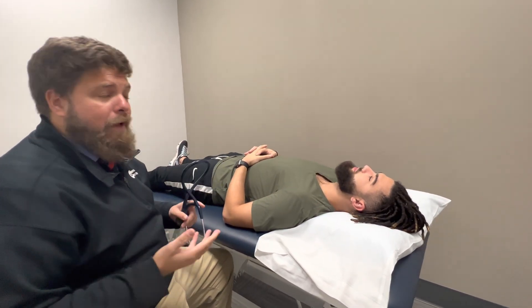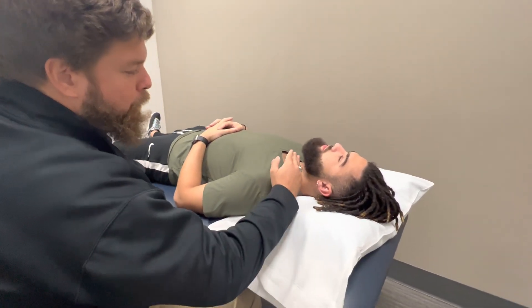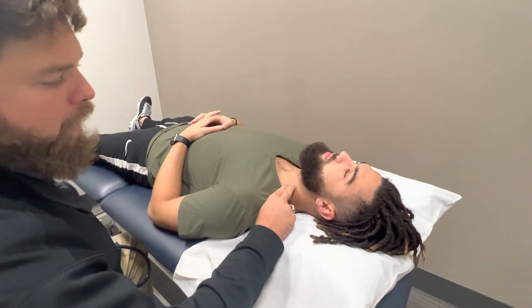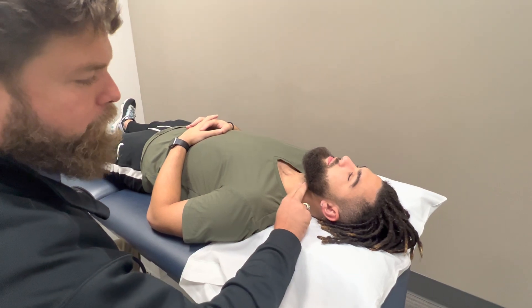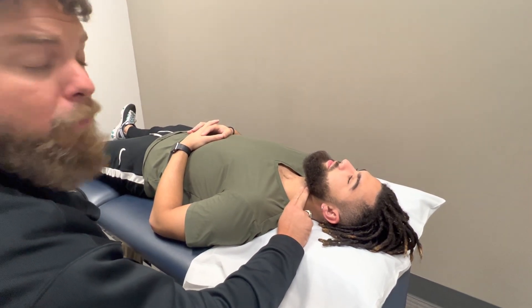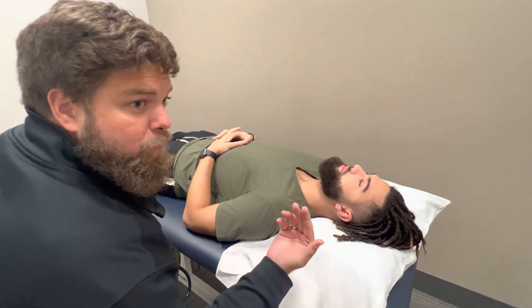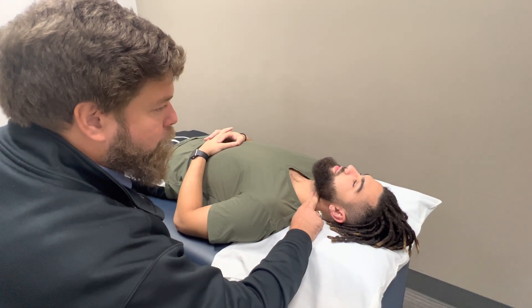So the first thing we'll do is identify the carotid artery. A really easy way to remember for most patients: you find the ramus of the mandible and just come down. You can form almost a barrier between the thyroid cartilage and the sternocleidomastoid, and it'll fall right in that triangle for most patients. It's a really easy pulse to identify. Some patients will even let you visualize it, but we'll palpate his here nice and strong.